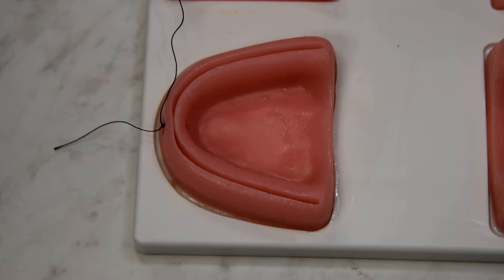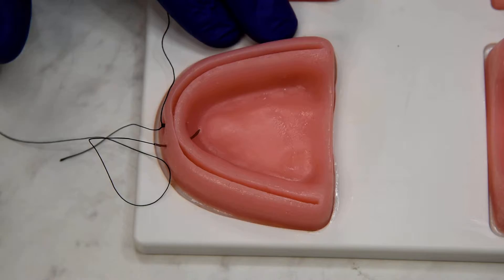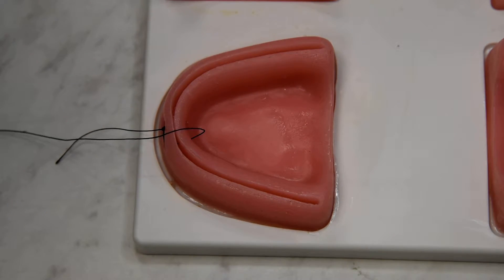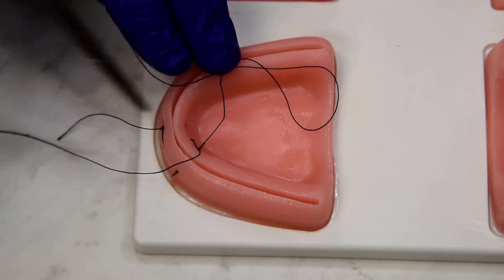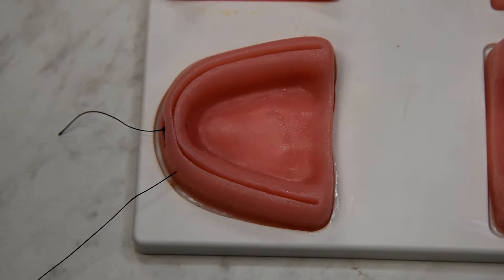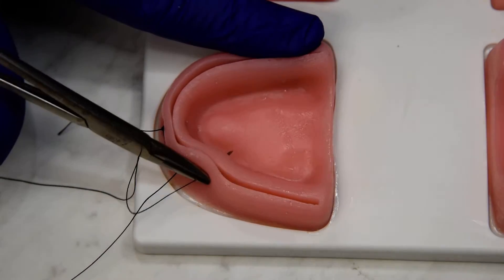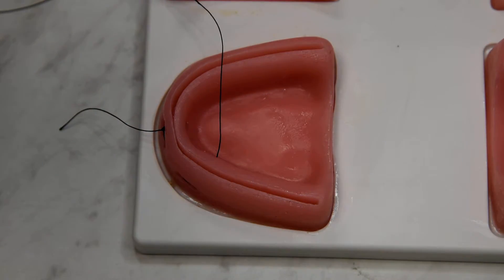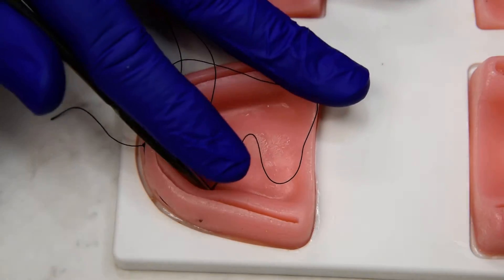We're going to now do a continuous mattress. We'll move about seven to ten millimeters down, bite through the buccal to the lingual and then from the lingual to the buccal — biting deep, or more apical, than our future continuous sutures will be. So seven to ten millimeters from the marginal tissue. And we're going to walk our way back like a square step all the way to the end of our wound.